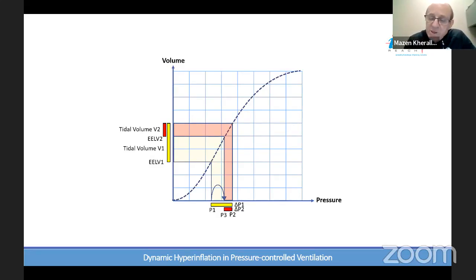Yes, it is challenging, it's difficult. I think it's case by case. I need to deal with it individually. But the concepts are the same: protective lung strategy for ARDS and providing prolonged expiration for auto-PEEP.